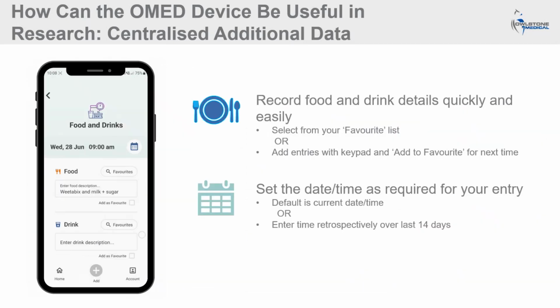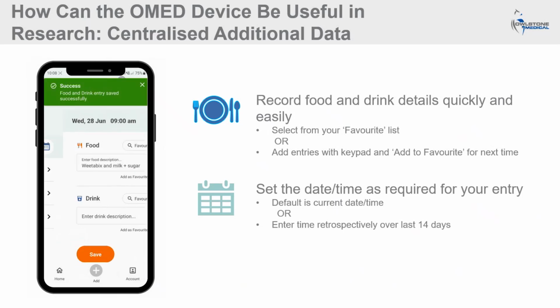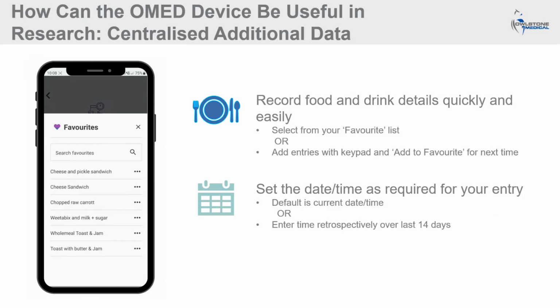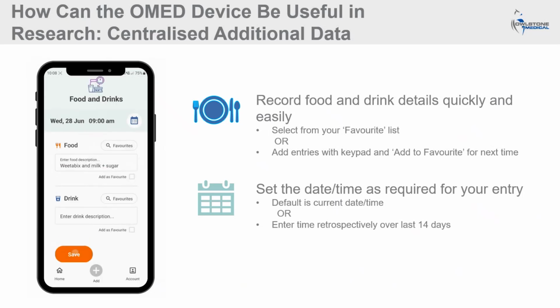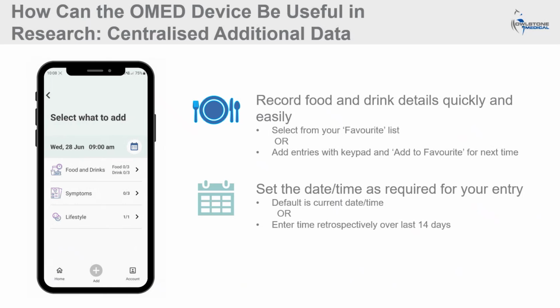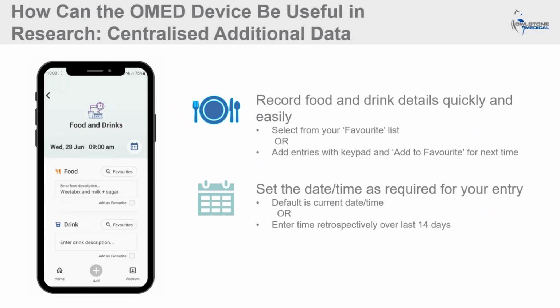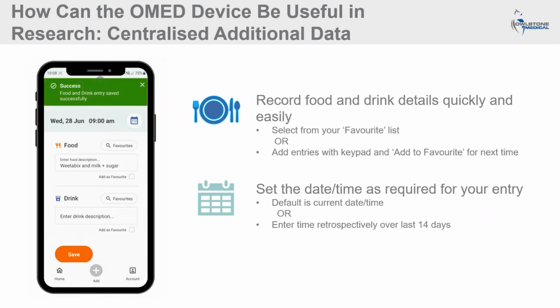Some of the other things that we're measuring in the app might also be quite useful for monitoring in clinical studies and might provide a single point of use for the patient to interact with and make the clinical trial just that little bit simpler. So I did talk about this earlier in the presentation, but I wanted to talk to you a little bit more detail about how this works.